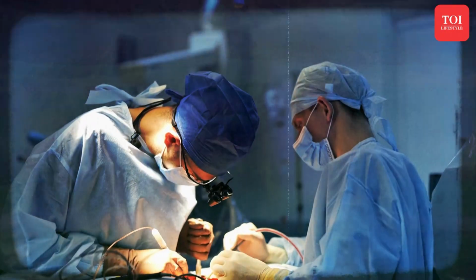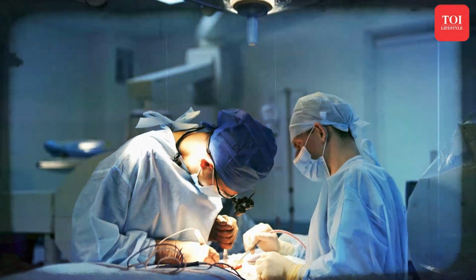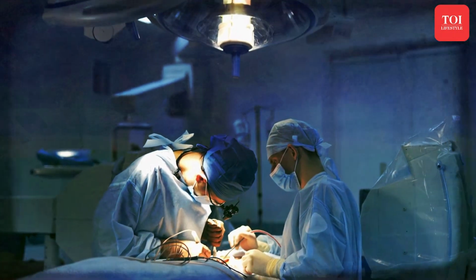We published our own data of 400 rotablator cases at EuroPCR, which is one of the largest conferences in interventional cardiology, held in Paris. Rotablator or rota angioplasty refers to using rotational atherectomy, which is a drilling device made of diamond which rotates at a speed of 160,000 revolutions per minute, and we ablate the calcium from inside the lumen of the vessel.